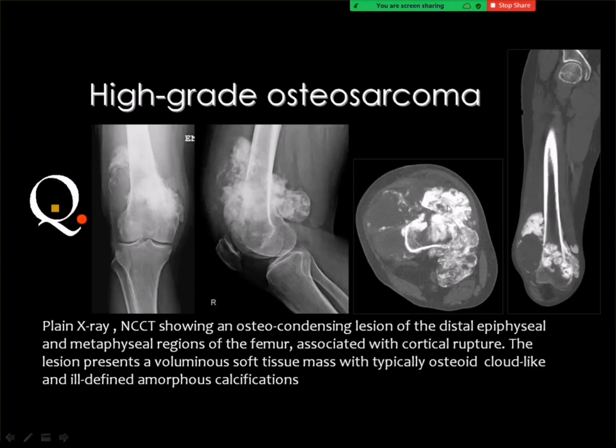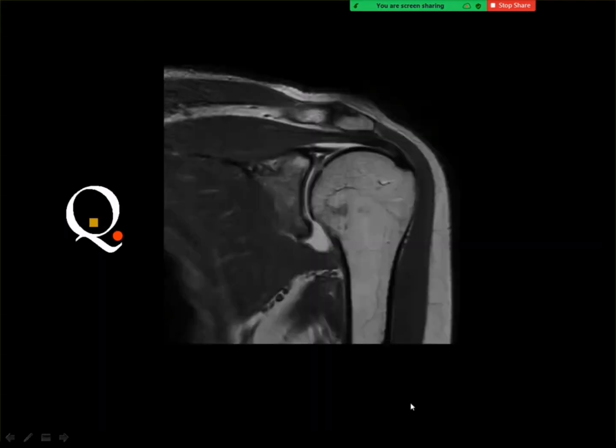Of course, the extensive calcification and the areas of bone destruction and so on in the metaphysis of the long bone may suggest the possibility of osteosarcoma. But if your answer is chondrosarcoma, it can be considered as a right answer.